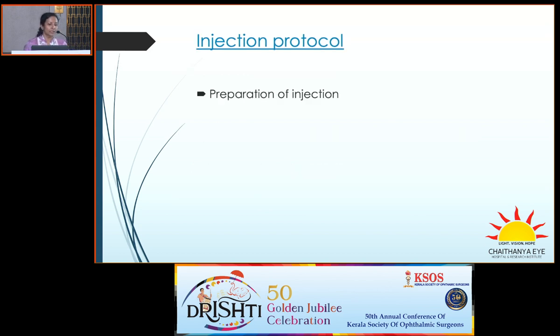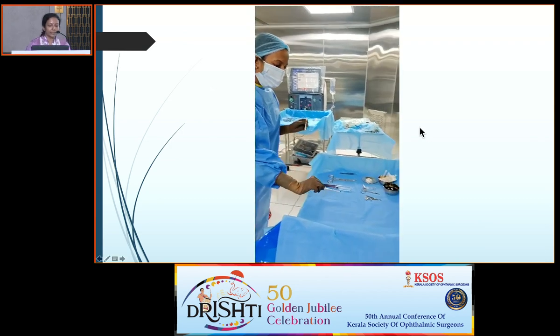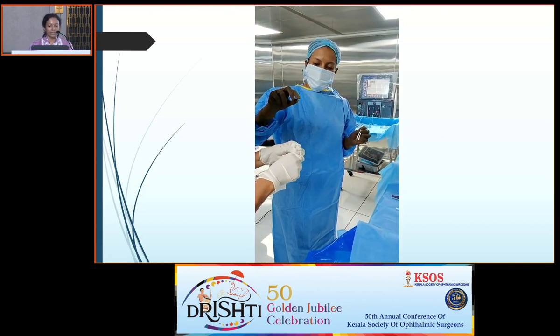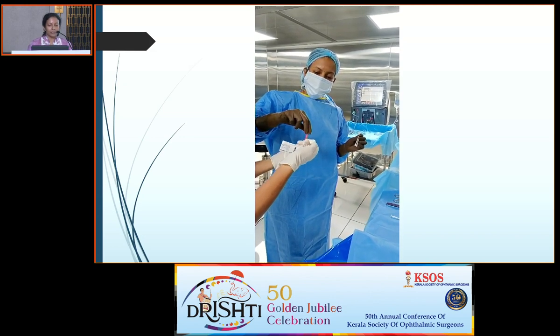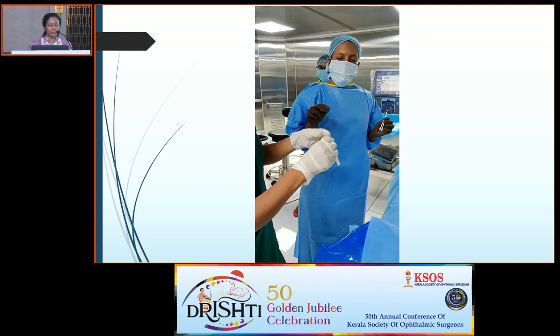Now coming to the injection protocol that I follow. So the first is about preparation of injection. As you can see here, I'm fully scrubbed. I have put on the surgical gown. I'm keeping everything ready. So the sister hands over the syringe. And this is the filter needle that is used to withdraw the injection from the vial.